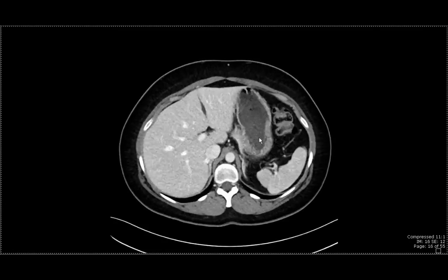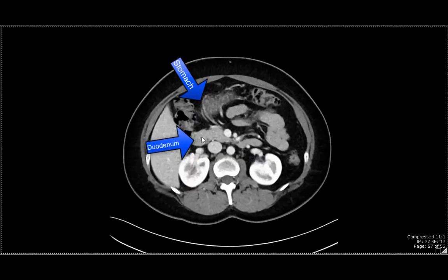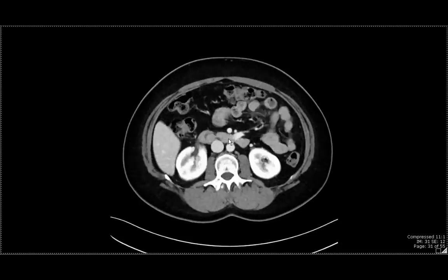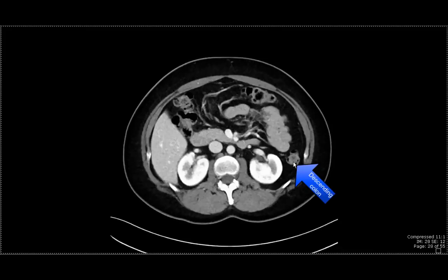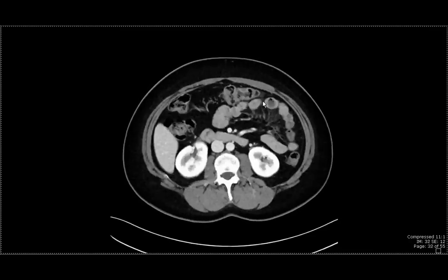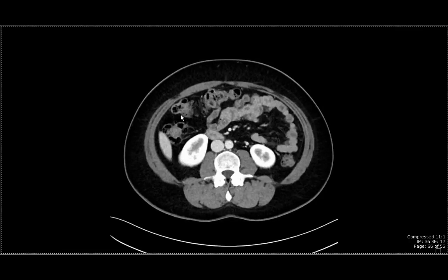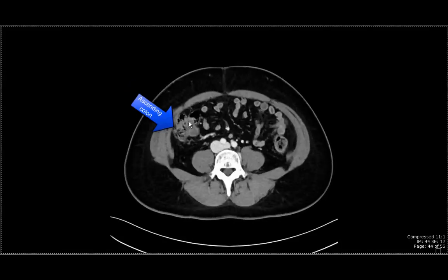This structure here is going to be the stomach. As we scroll down, we can see the distal aspect of the stomach, and as we go down over here, we're going to see the duodenum. The duodenum comes across from the right side of the patient to the left side of the patient, crossing the midline. We can also see the descending colon, which we can follow upwards to the splenic flexure where it meets the transverse colon. The transverse colon goes across to the hepatic flexure near the liver, and downwards is the ascending colon.